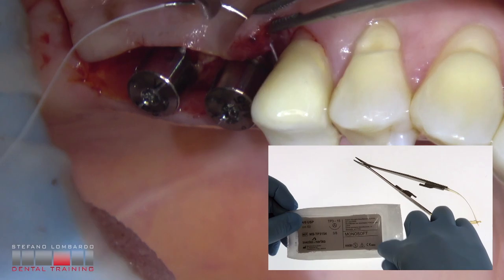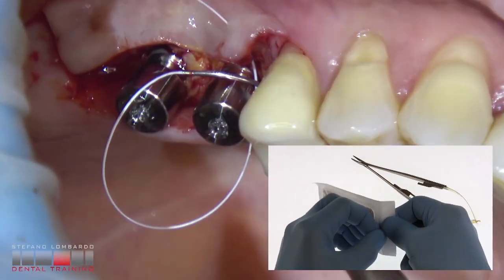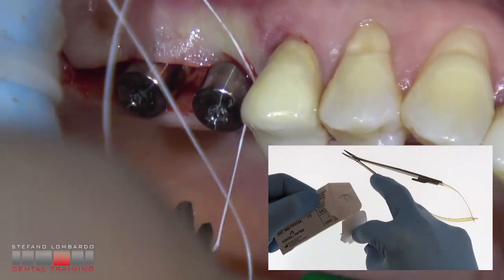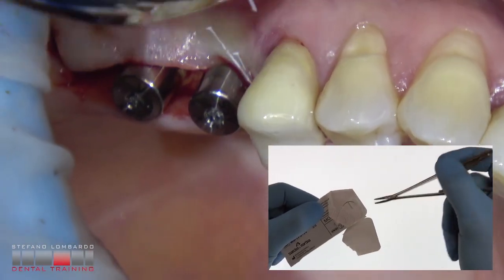Closure of the surgical flaps with the Sweden and Martina Monosoft surgical suture — monofilament non-absorbable PTFE 4.0.